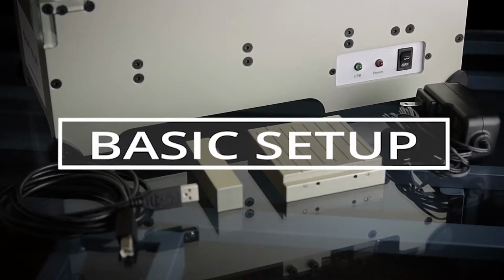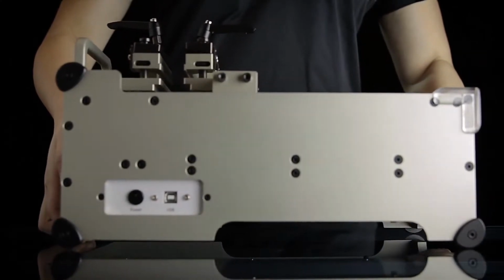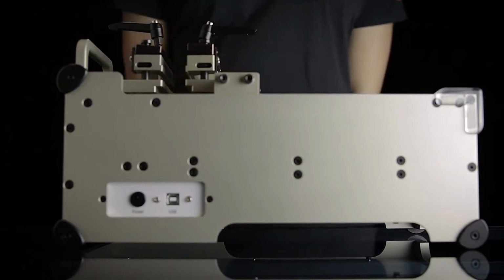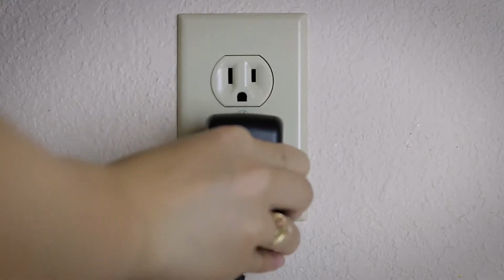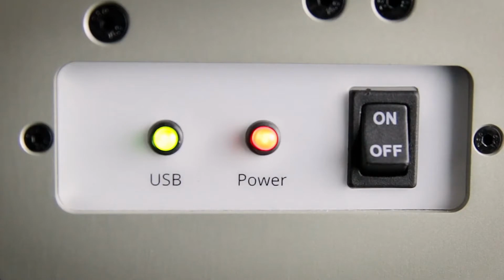You are ready to begin setting up your FAB machine. Ensure your FAB is positioned on a flat, stable surface so the testing sensors do not pick up extraneous movements from the surrounding environment and potentially corrupt your data. Connect the FAB power cable. Run the cable from the FAB power outlet to the wall power outlet and turn it on. The red power indicator light shows that the FAB is receiving power.